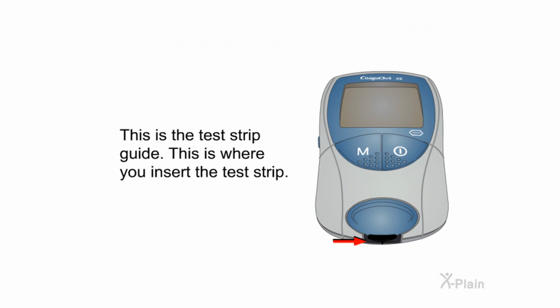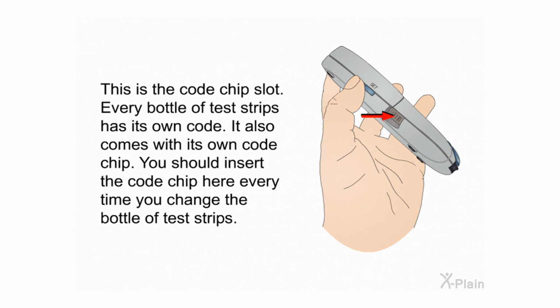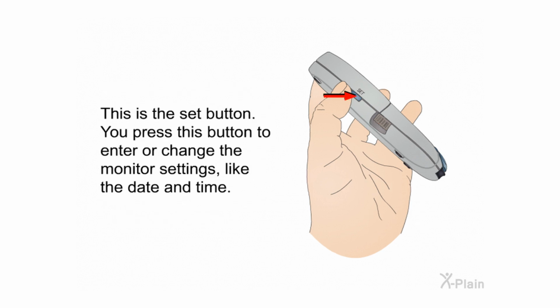This is the test strip guide. This is where you insert the test strip. This is the code chip slot. Every bottle of test strips has its own code. It also comes with its own code chip. You should insert the code chip here every time you change the bottle of test strips. This is the Set button. You press this button to enter or change the monitor settings like the date and time.